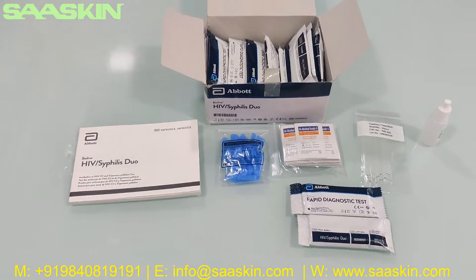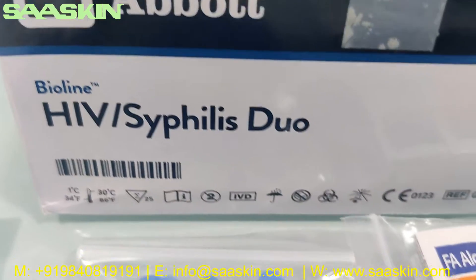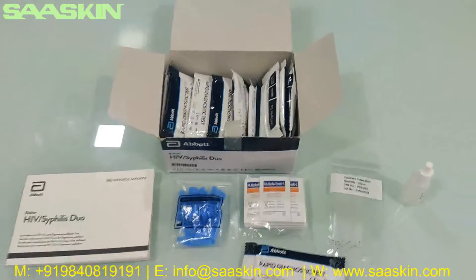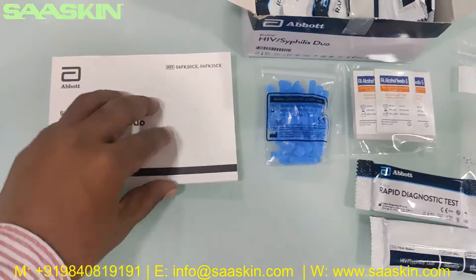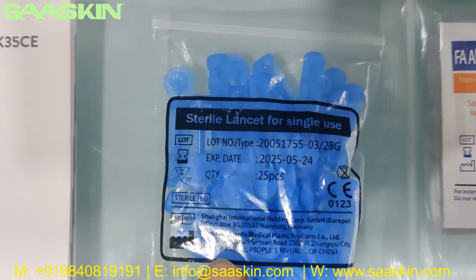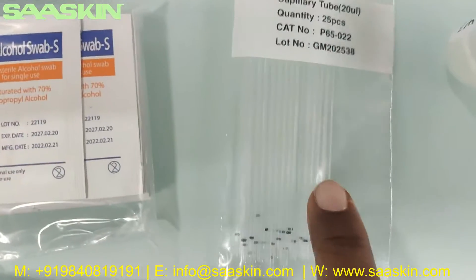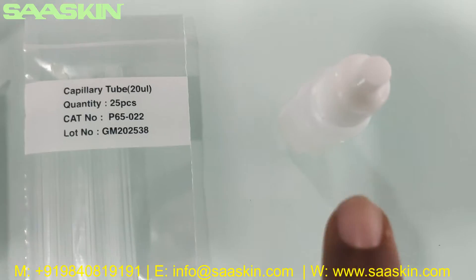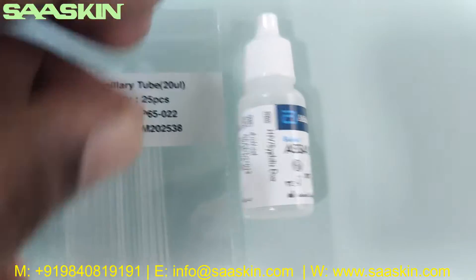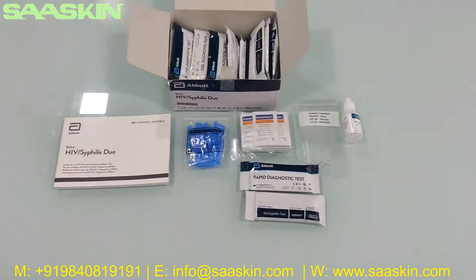To quickly summarize: today we have seen the unboxing of the Abbott Bioline HIV Syphilis Duo Test Kit, reference part number in a 25 test kit pack. You get one instruction booklet, 25 pieces of safety lancets, 25 pieces of alcohol swabs, 25 capillary tubes, a 4 ml diluent buffer, and 25 test cassettes. This is how the total test kit looks like.